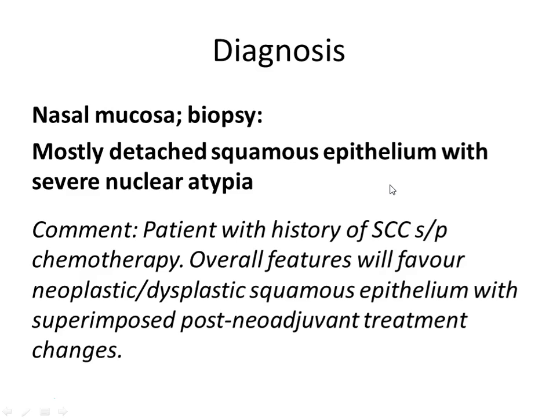So this case was signed out as mostly detached squamous epithelium with severe nuclear atypia, with a comment that the overall features will favor neoplastic or dysplastic squamous epithelium with superimposed post-neoadjuvant treatment changes.